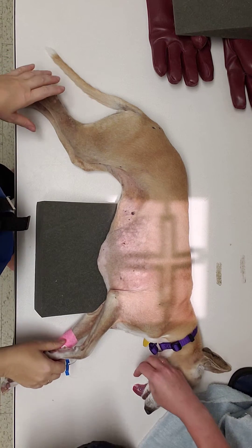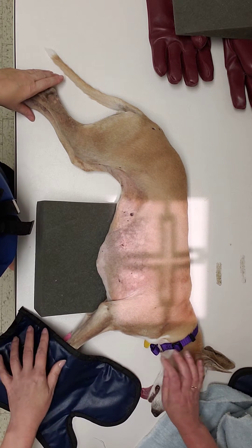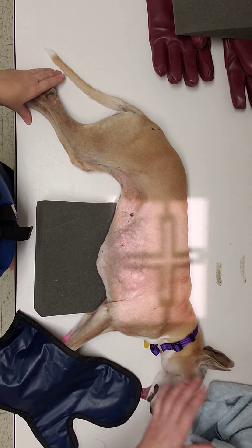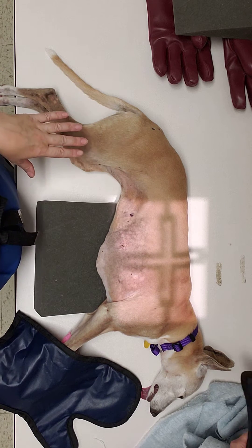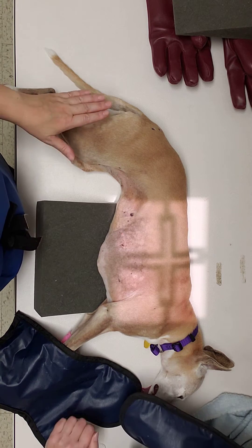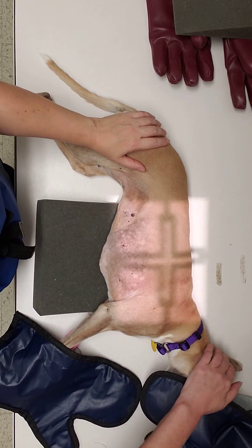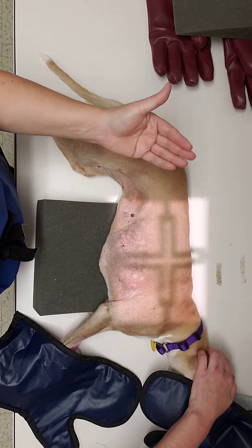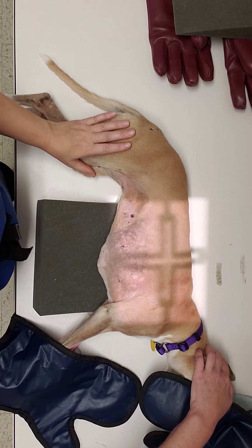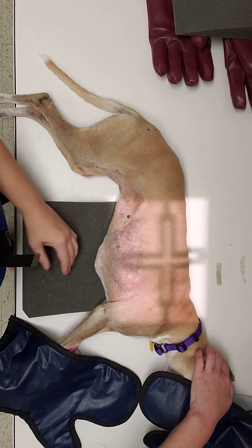We're going to talk about how to position our patient for a lateral thorax radiograph. The doctor will determine whether they want right lateral, left lateral, or both. We're going to lay our patient in lateral recumbency — the side you want down is the side it's named for: right lateral, right side down; left lateral, left side down. We're going to use our positioning device because we want our sternum to stay level with our spine.